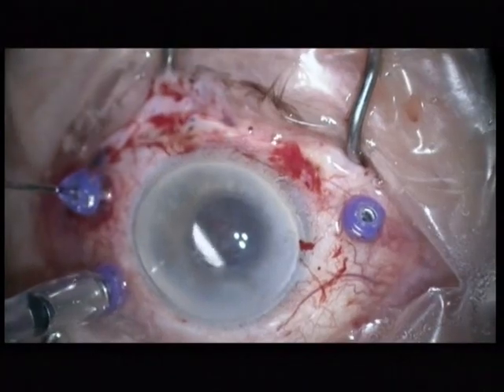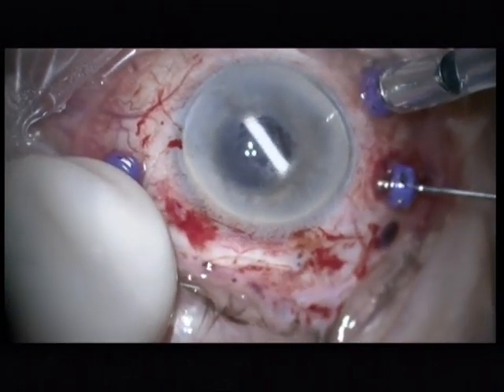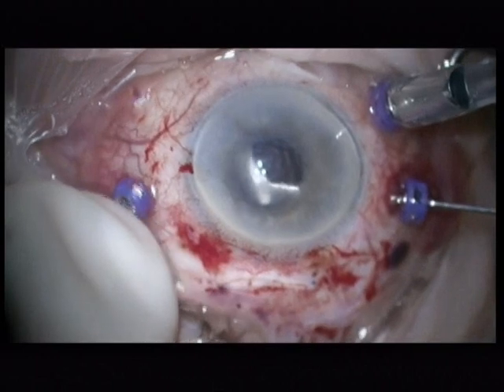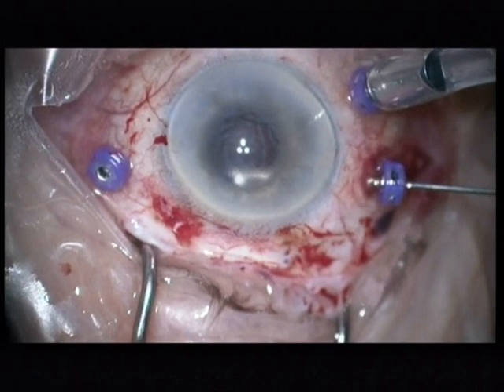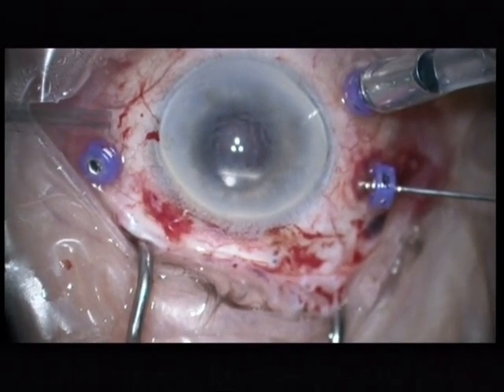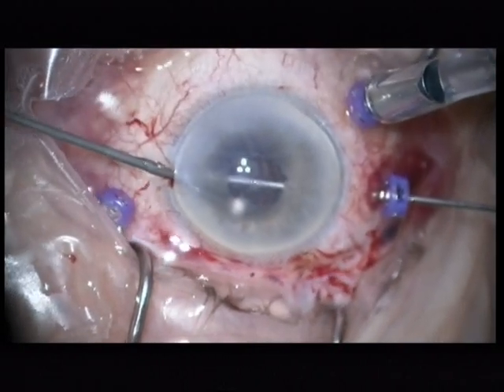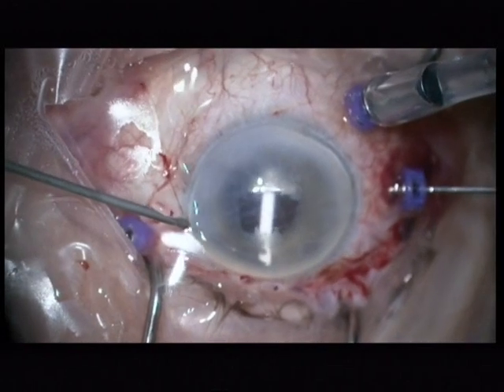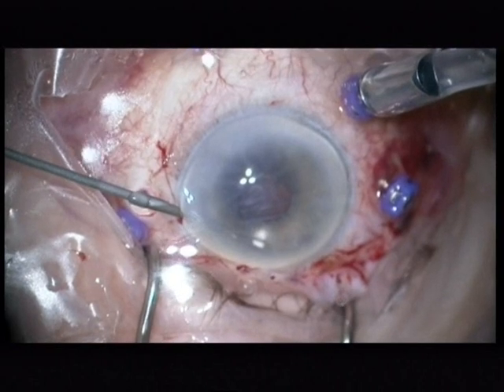Now let's go over to the next item, which is the Ozurdex pellet. I grab this with an intravitreal forceps, again up to the pupil. The Ozurdex pellet is rather soft, so you can easily break it by pushing too hard with the forceps. I'm losing the pellet, so I'm trying to get it with the second forceps. Now I broke it in two parts.